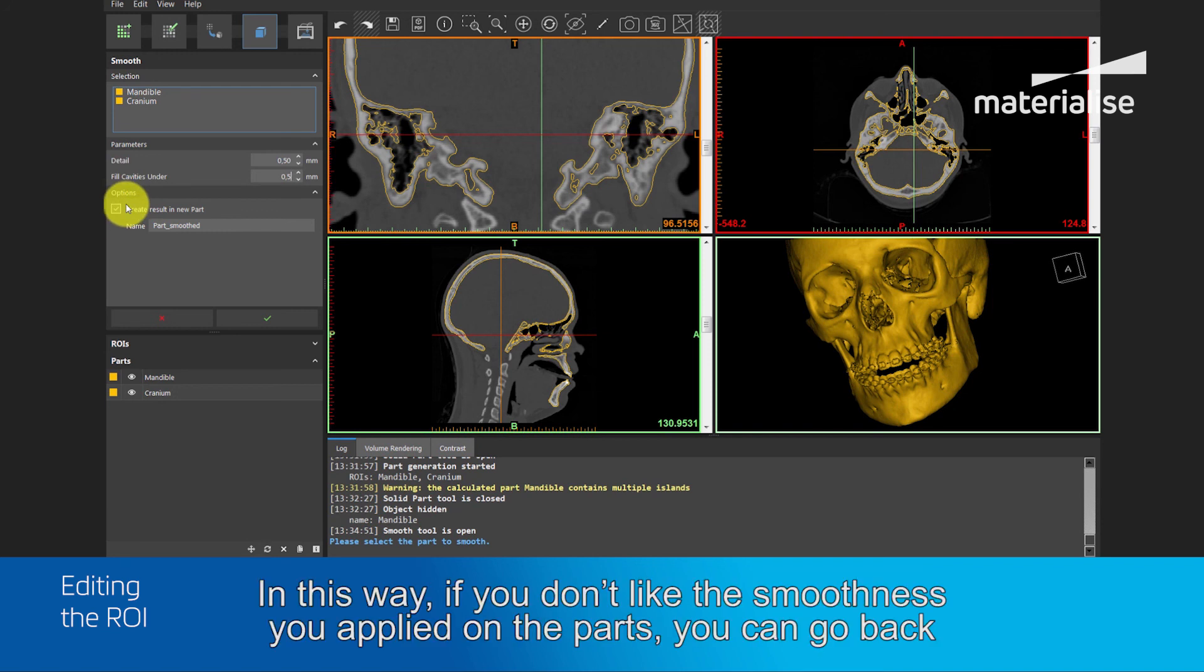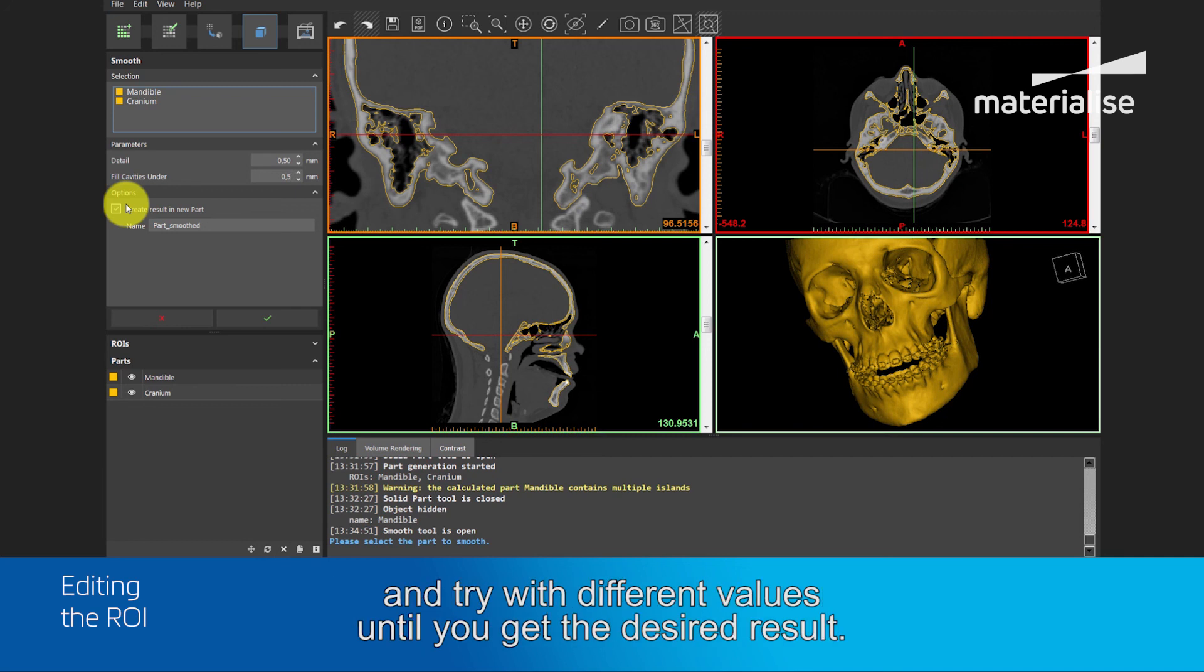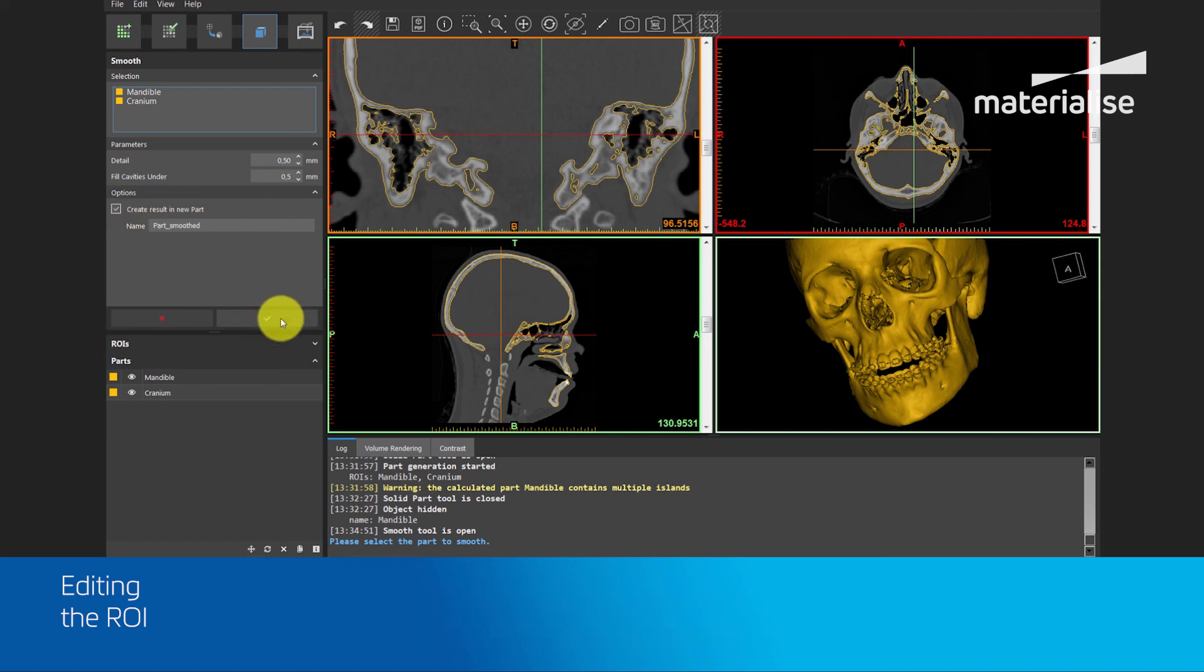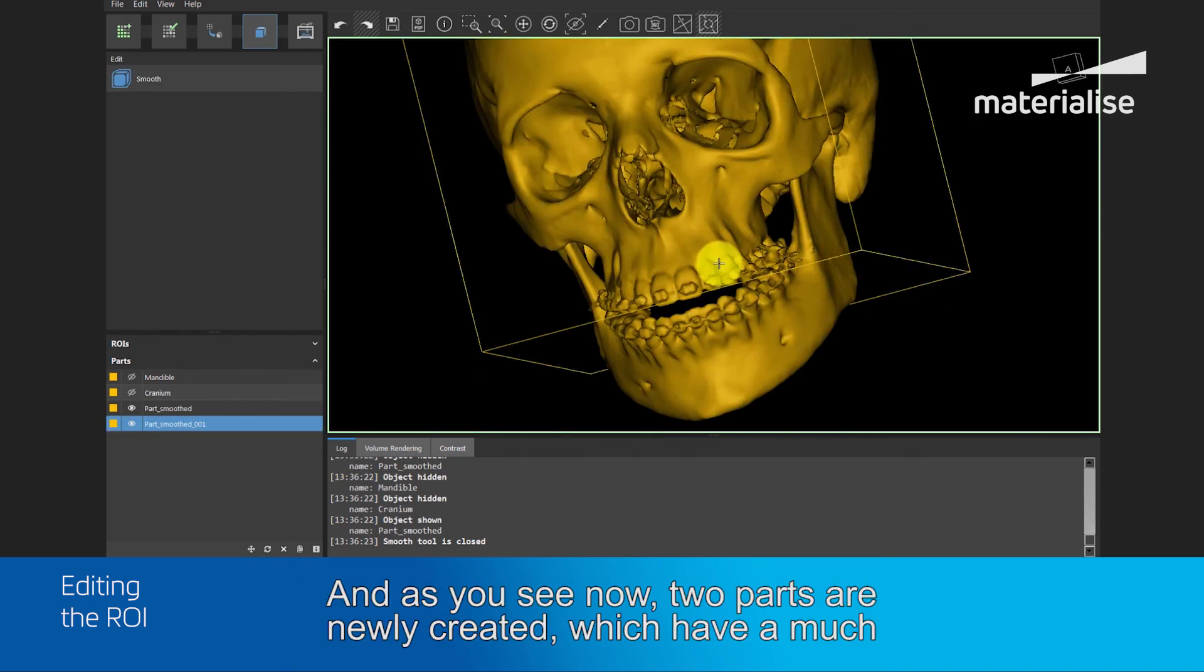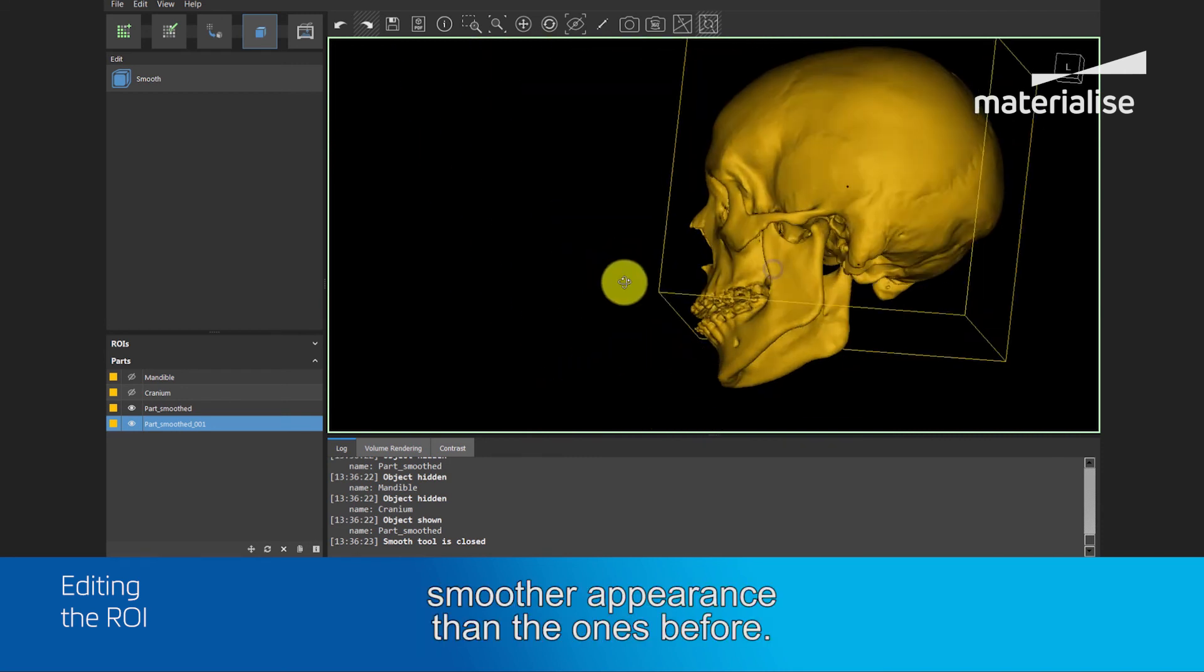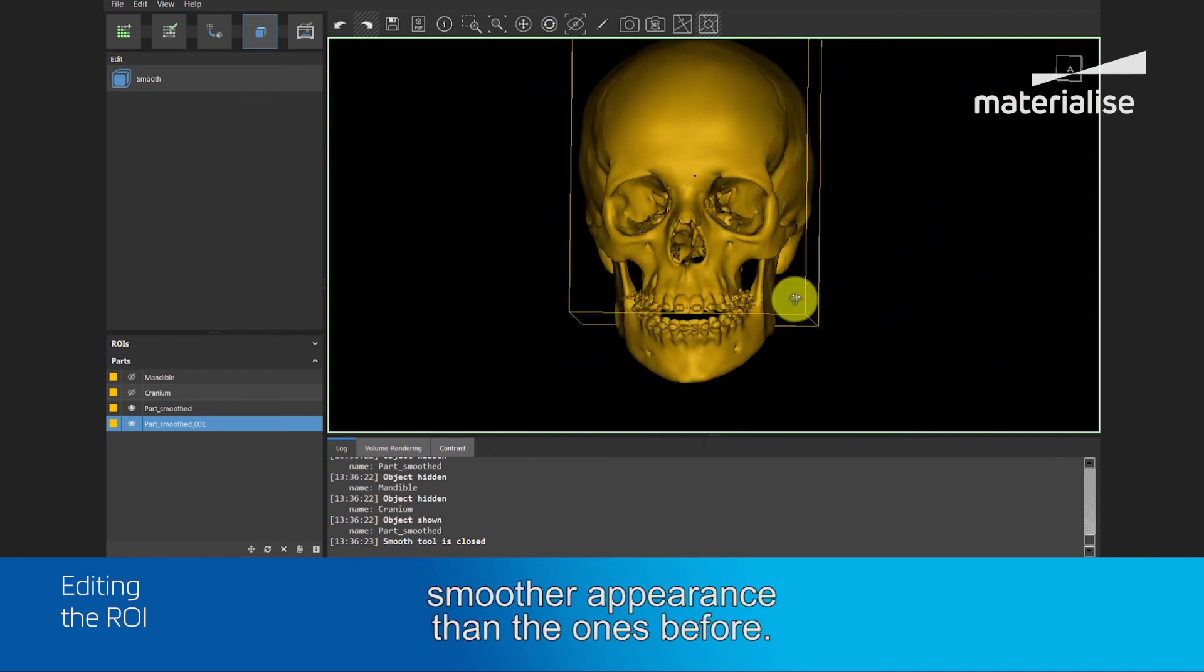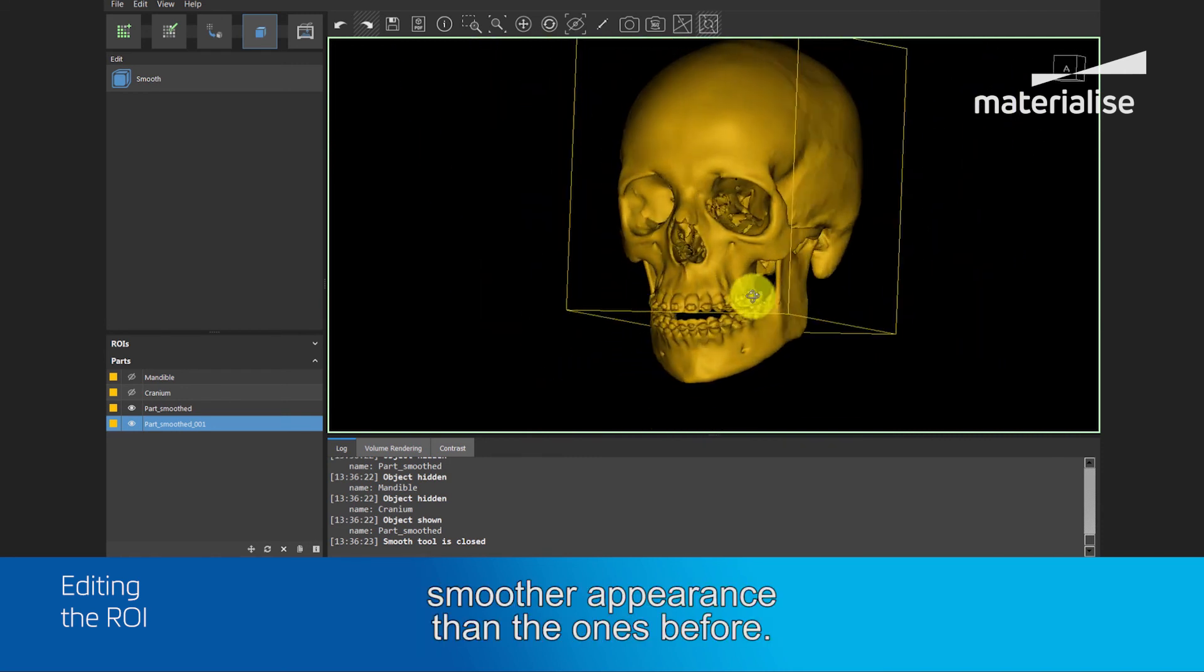In this way, if you don't like the smoothness you have applied on the part, you can go back and try with different values until you get the desired result. And as you see now, two parts are newly created, which have a much smoother appearance than the ones before.